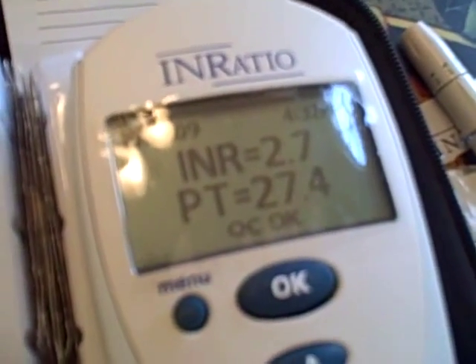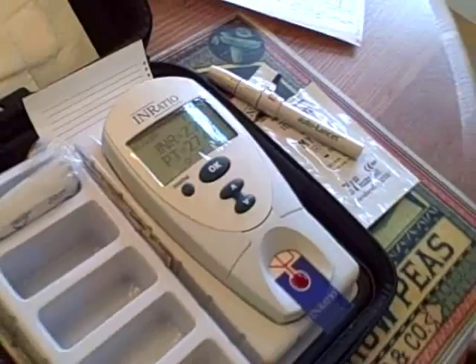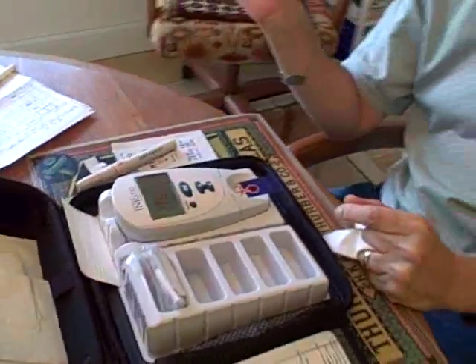What does it say? 2.7. My goal is 2.5 to 3.5 units. So I'm going to stay on the medicine that I'm on, the dose of Coumadin that I'm on, and retest in a week.